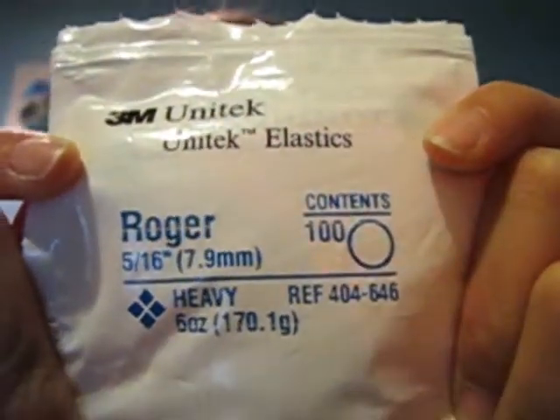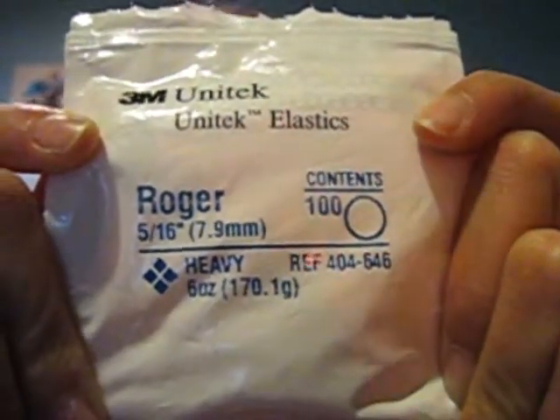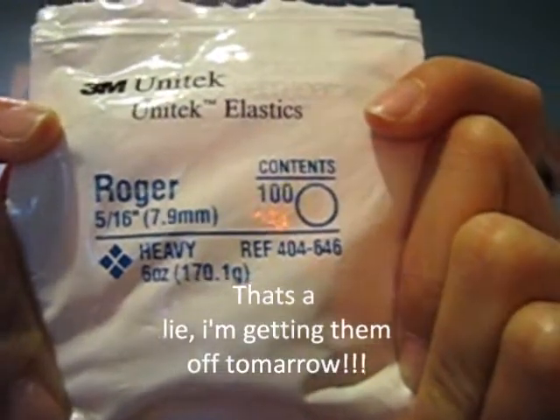I have to wear these elastics at night now. I probably had to wear elastics about 12 months out of my 15 months, and I get my braces off in two days — I'm really excited about that. Your orthodontist is going to give you a different way to put them on for each person. I'm supposed to wear them on both sides but I only wear them at night.